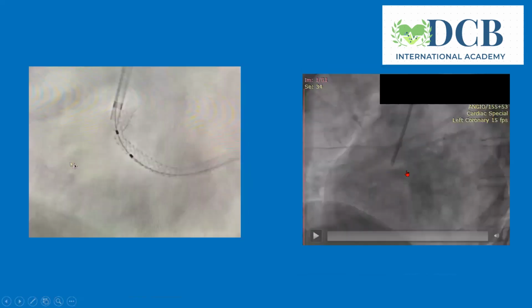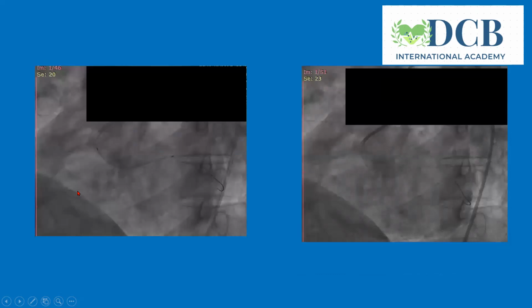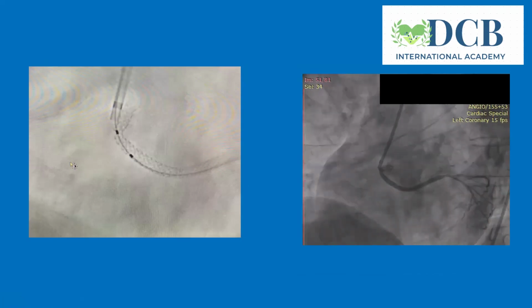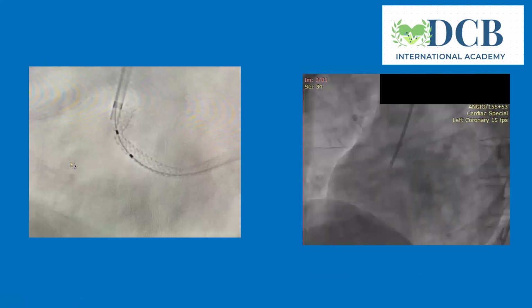So this is post-stenting, and then we started post-dilatation. We started from distal to proximal. When we tried to position the proximal, we took a stent boost. Only then we realized, actually, I missed one point. We lost the wire after we stented, unfortunately, because the patient took a deep breath and we lost the wire. Then we rewired, and the post-dilatation balloon was 3.5 by 12.